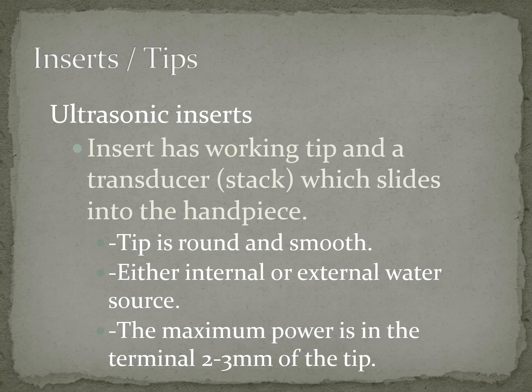So the tip is round and smooth. Okay, and like I said, that water is going to either have an internal or external source. So external is where we saw the two metal tips coming out of the handpiece. And then the internal is you just have the one and there's a little hole in it, and that's where the water is going to come out. The maximum power is in the very end of that. The last 2 to 3 millimeters of that tip is where you're going to have the maximum amount of power.